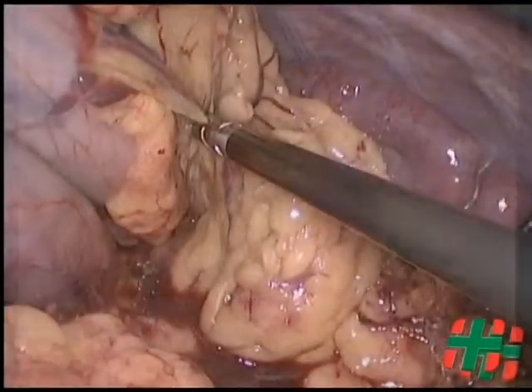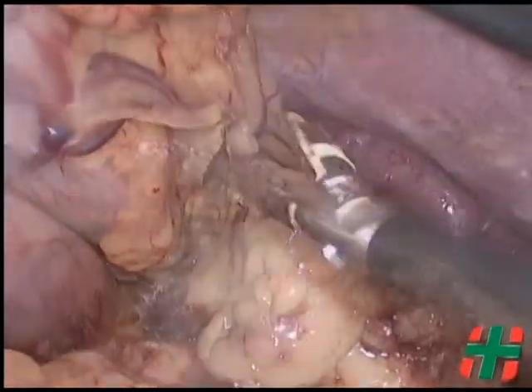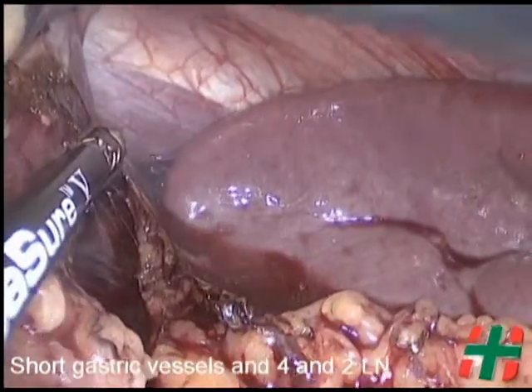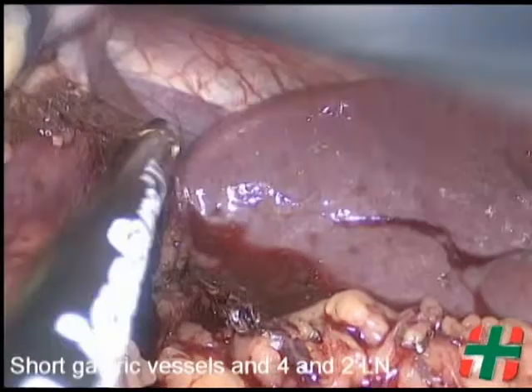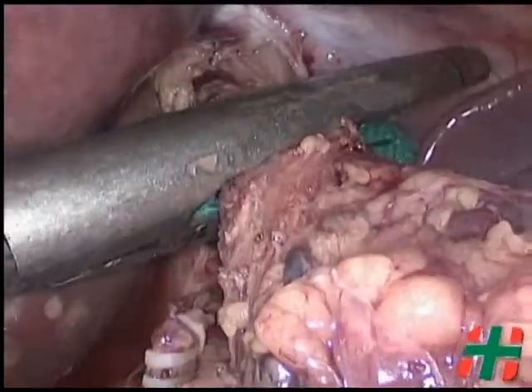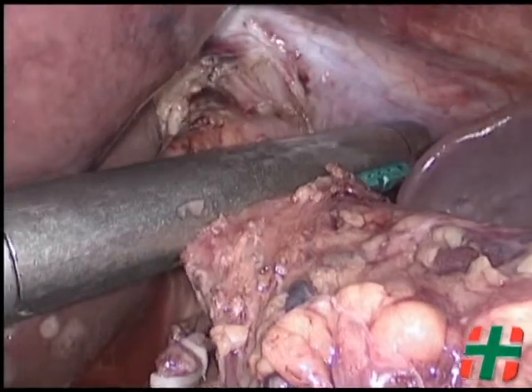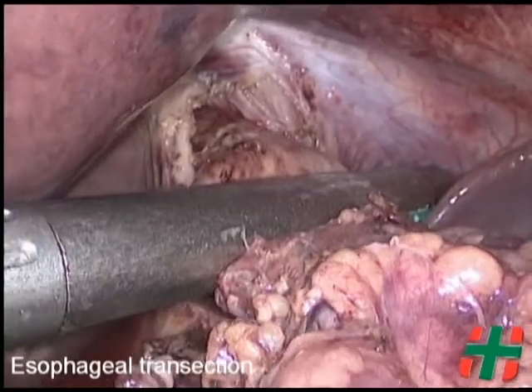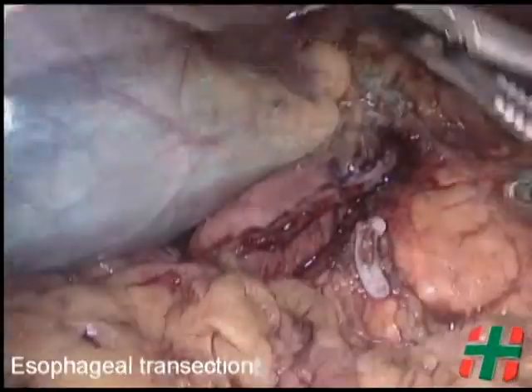For a total gastrectomy, dissection along the greater curvature continues, taking lymph nodes of the left gastroepiploic artery (4SB), short gastric vessels (4SA), and the left cardial nodes, number 2. The esophagus is then transected using an endoscopic linear stapler reload.